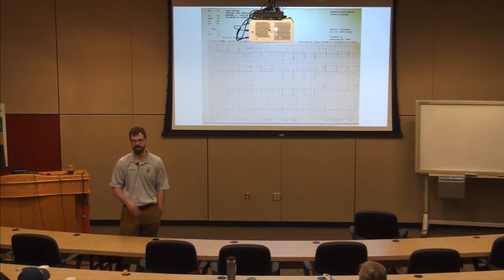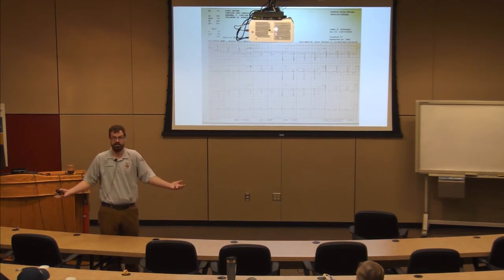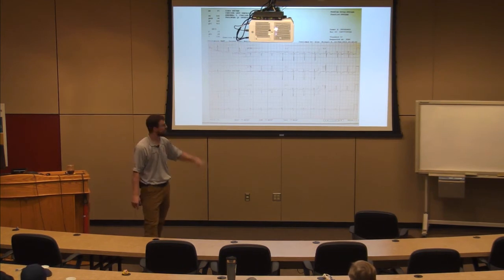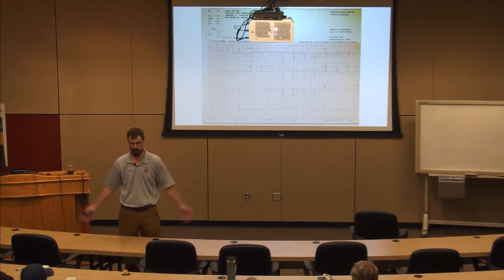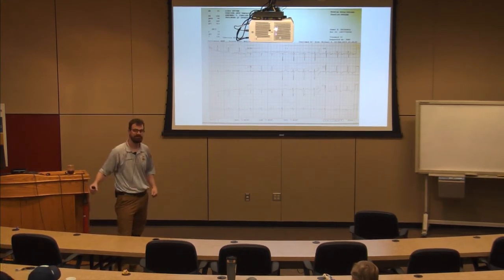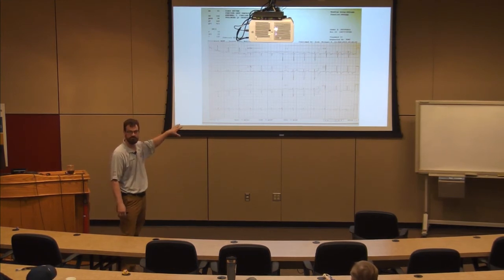And that's a case where, if I gave that guy Levaquin, I might have caused his torsades, right? So undiagnosed, you never know. It could be a small dose, it could be genetic. But in the setting of overdose, I'm going to get a 12 lead on that guy, and I'm going to shock him and resuscitate him. He already fibrillated or tacked, right? He already earned the resuscitation. In the setting of overdose, when we traditionally don't use the 12 lead EKG a lot, this is where there's benefit. Okay, does that make sense?